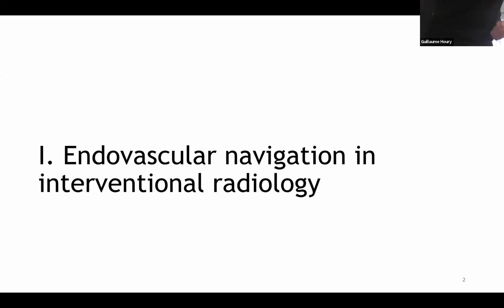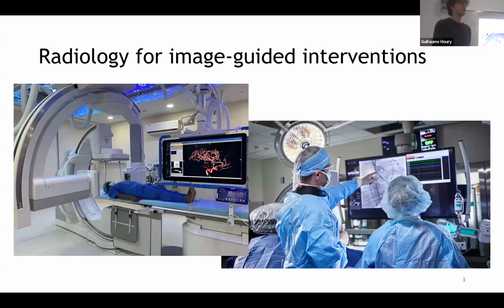So interventional radiology is a medical specialty where the medical doctor performs operations in an image-guided way in real time. This is how a surgery room typically looks, with a big scanner in the middle of the room that can move in the 3 dimensions of space. Thanks to this imaging device, the radiologist can get feedback on the operation in order to adjust what he's doing in real time.